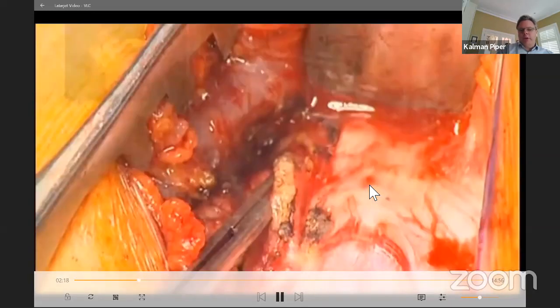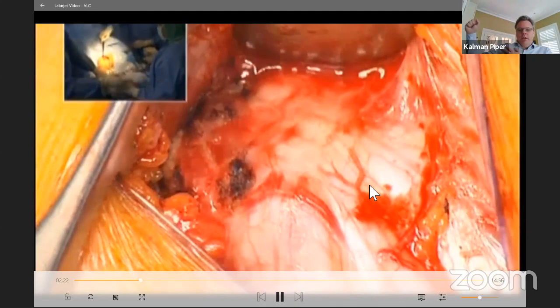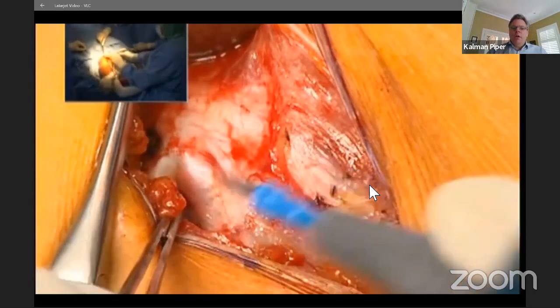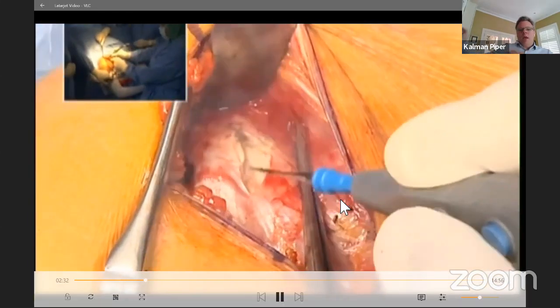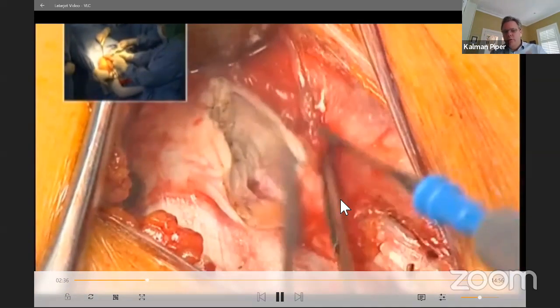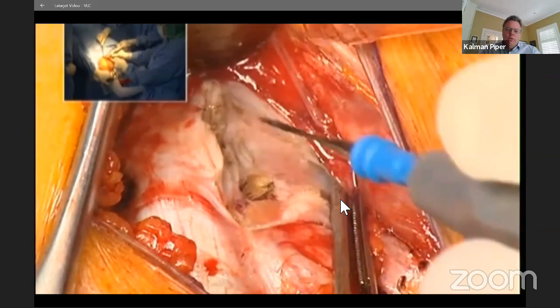The best way to access the lateral side when you're using a small incision is to abduct the arm and externally rotate the arm, and that will help expose the lateral side of the coracoid process. And then when you're ready to detach pec minor, you adduct the arm again, and that'll help move the soft tissue window to the medial side of the coracoid process so that you can continue your dissection.